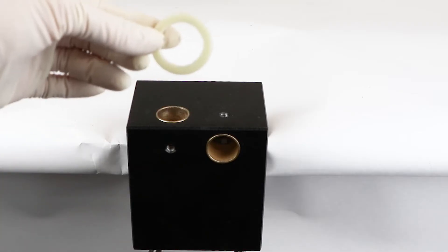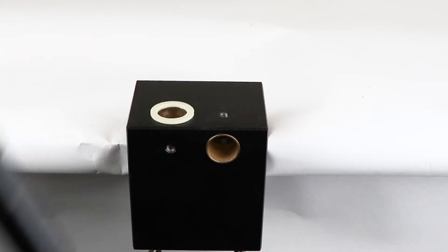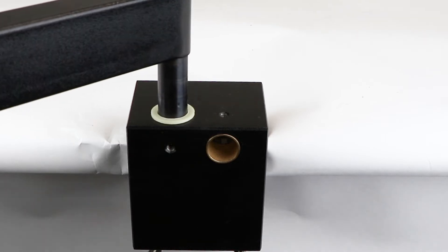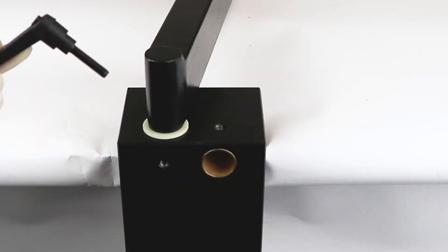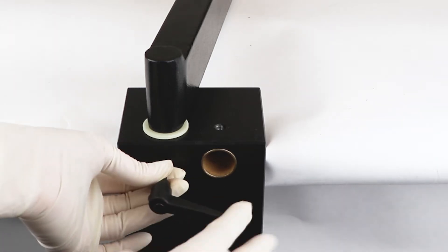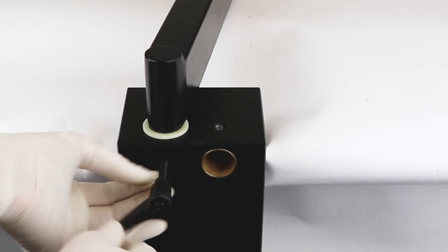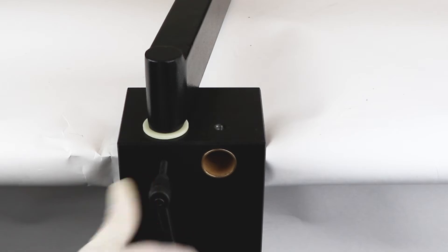Place a white ring washer on the top of the table clamp and line it up with the hole. Then insert the post of the middle horizontal bar into the hole on the top of the table clamp. Install the clutch handle by lining up the screw end with the screw hole in the side of the table clamp and rotating the handle clockwise to tighten it. This handle secures the position of the middle horizontal bar.